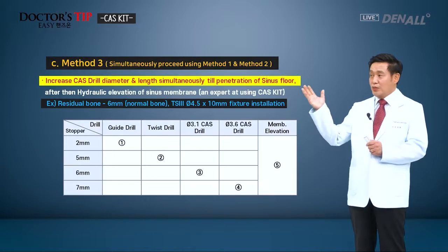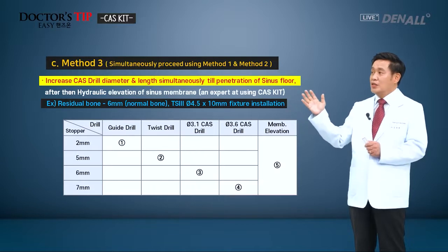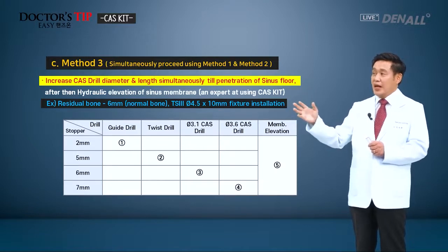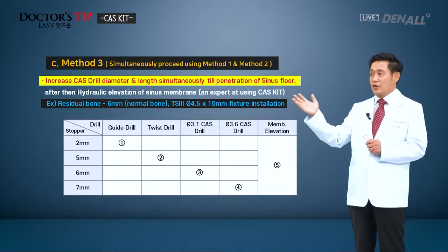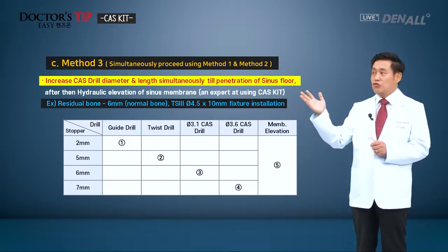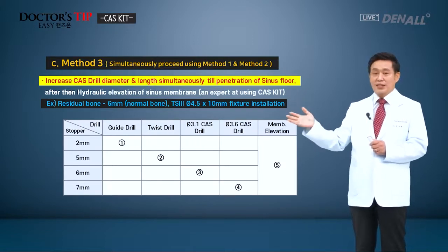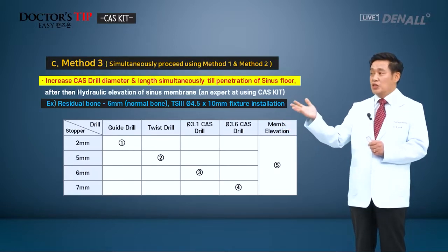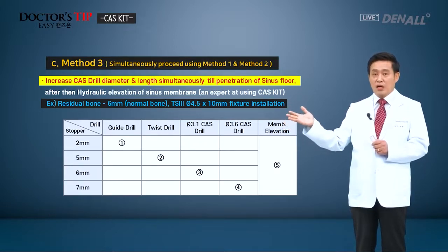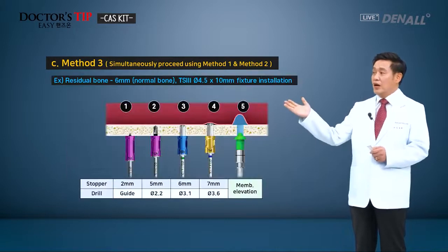Next, method 3. This is the combination of method 1 and 2, previously explained. The CAS drill's diameters are increased. At the same time, the lengths are increased as well to easily penetrate into the sinus floor. The drilling sequence is reduced. In this way, if you get used to the CAS drilling, you will be able to do it easier. The drilling sequence can be greatly reduced or simplified.